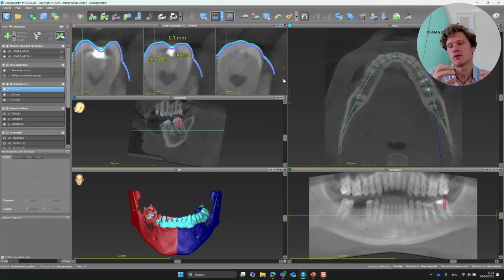And if we target just one part of the jaw, you will not have any opportunities. You receive your scan, yes, you can do your surgery, but if something goes wrong, you will need to make one more CBCT. And if you make one more CBCT, there will be a double dose. The ITI guidelines and the ICRP guidelines tell us to use as low a dose for the patient as possible, but we need to use the FOV as small as needed.